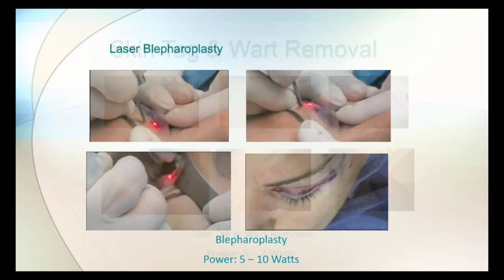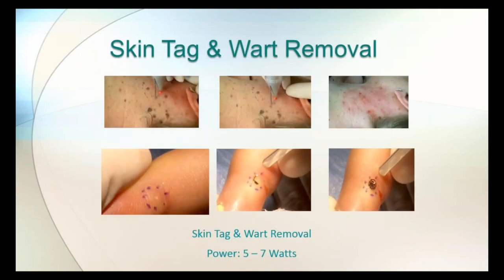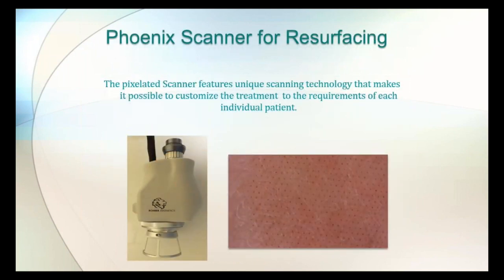The thing I really love it for is skin tags, warts, moles, those things that, when you do them with a knife and then go back and secondarily cauterize the bed, can take quite a long period of time, and it speeds up that type of work immensely. And so just really enjoy using this as a tool for those types of treatments. But the mainstay of what you're going to use your CO2 laser for is going to be for skin resurfacing.